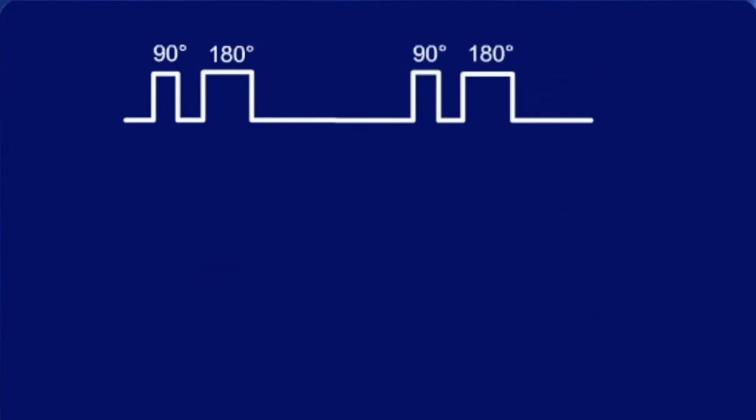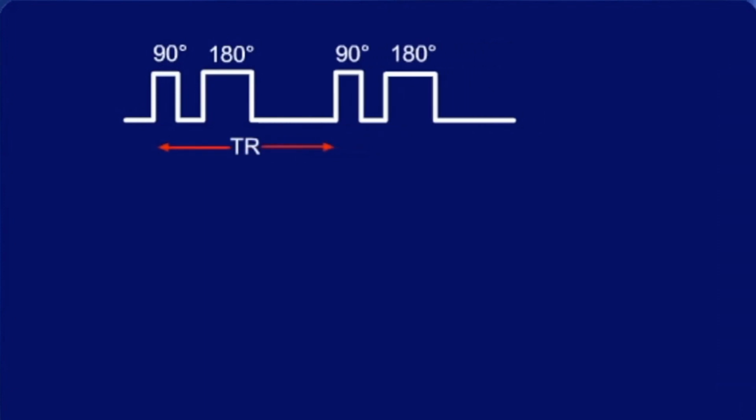As you may already have noticed, the TR is the most time-consuming parameter of an imaging sequence. It makes sense to shorten TR if we want to make imaging faster. And this is done in the fast imaging sequences. But with the decreasing TR, there are some problems.